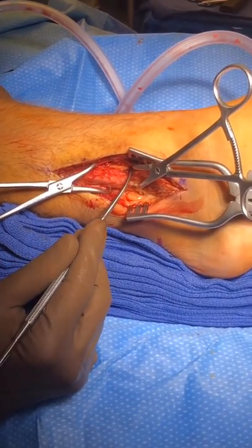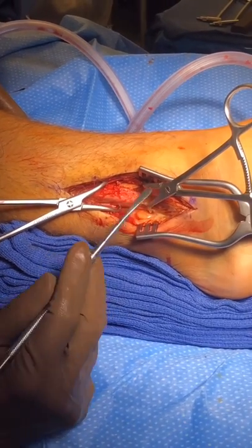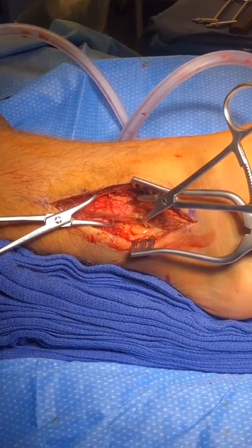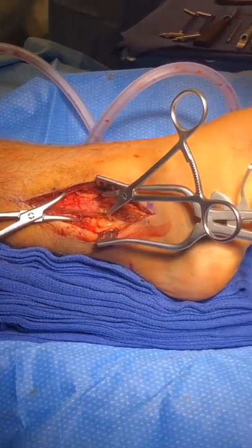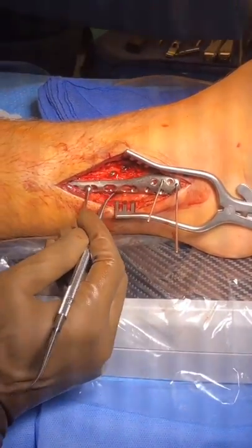So here we've reduced the fracture anatomically. You can see the fracture line here, and we've held it with two pointed reduction clamps. And so now we'll go ahead and put our lag screws, and then from there put our neutralization plate. Okay, now we've put two lag screws to compress and hold the fracture.